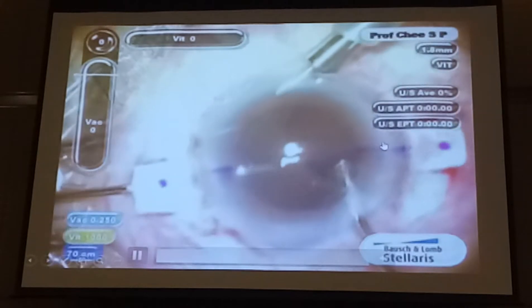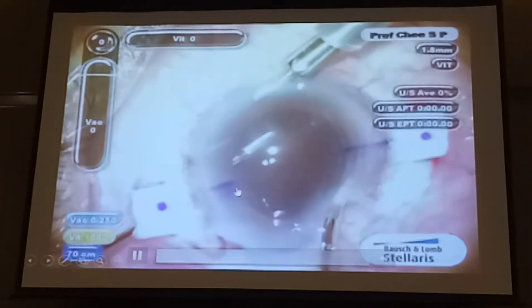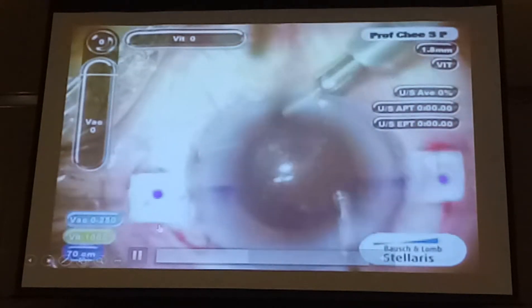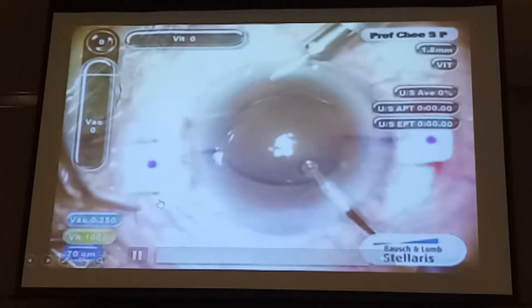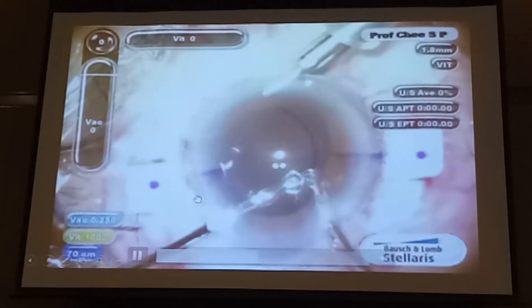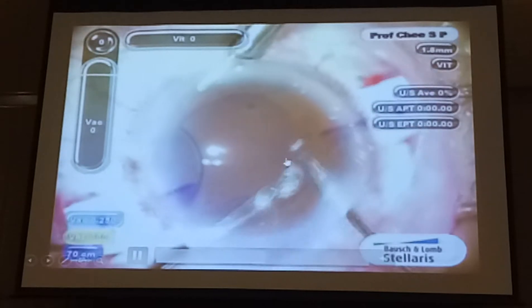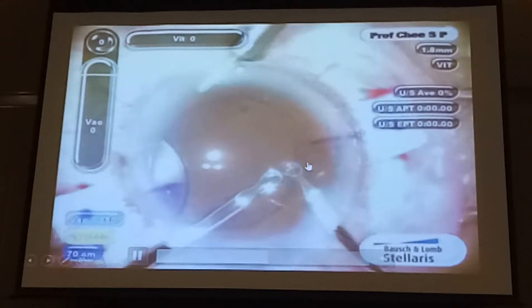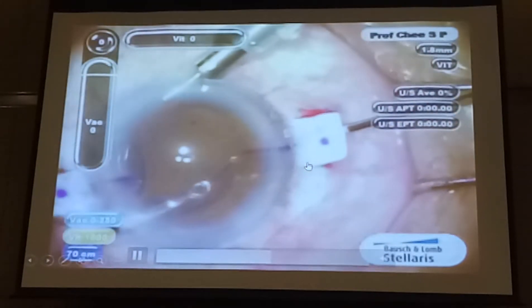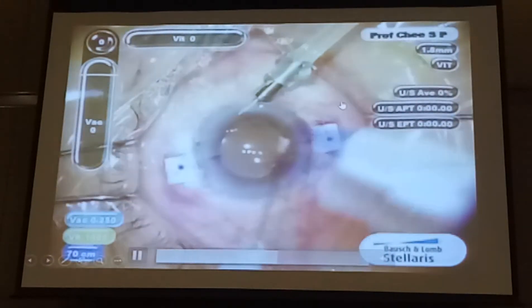Now, this lens was iris-fixated, so I just release it a little, hold onto the tip with special forceps that don't damage the tip. Retrieve it. In this case I was asking my assistant to hold, but generally I don't need an assistant today with the techniques that I use. This was attached to the iris, so I'm just converting it to intrascleral haptic fixation. The forceps will just grasp the tip.